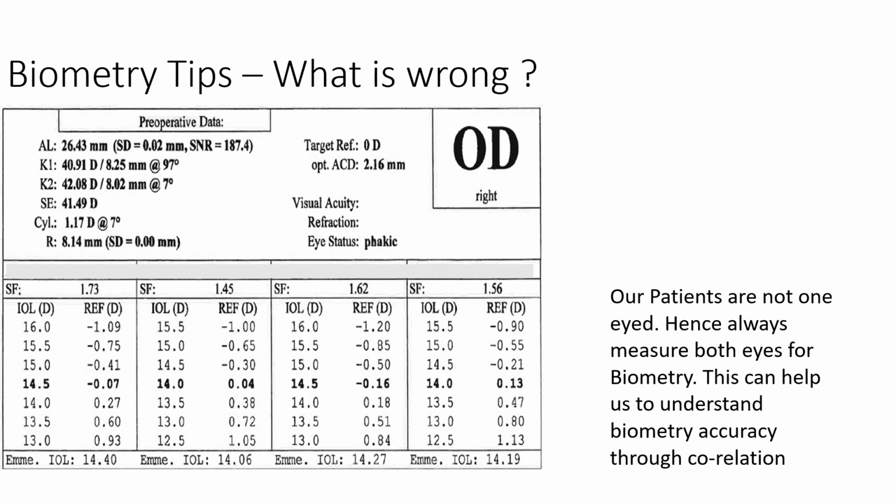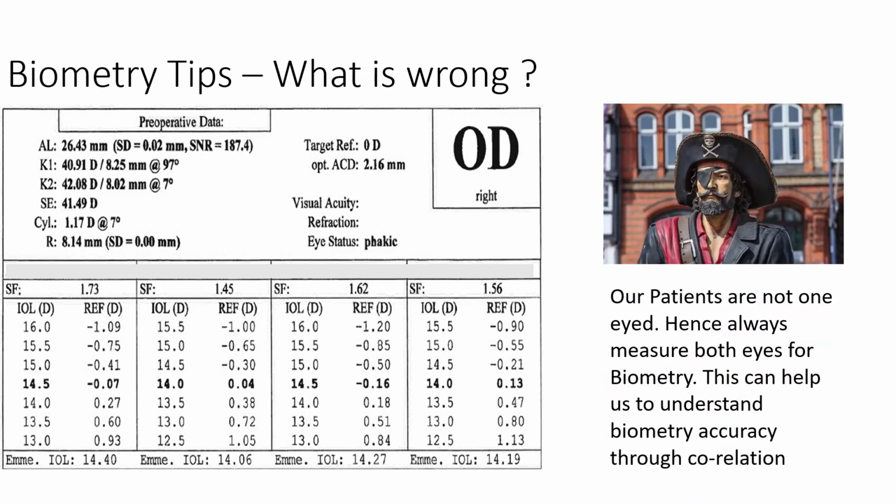As we understand, the comparison between the two eyes is very important to rule out wrong measurements. For example, in keratometry readings, a difference of 1 diopter between the two eyes' corneal readings calls for another round of measurements of the cornea.